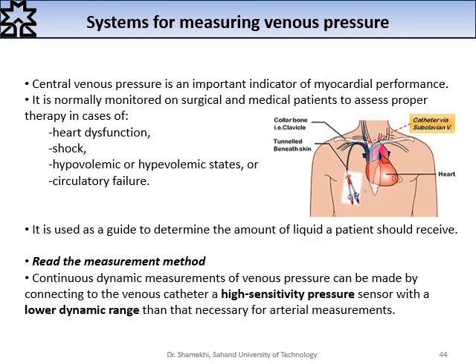In this slide, as you can see, central venous pressure is measured via a specific method. Central venous pressure is an important indicator of myocardial performance.